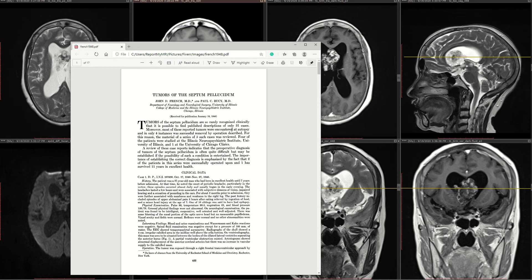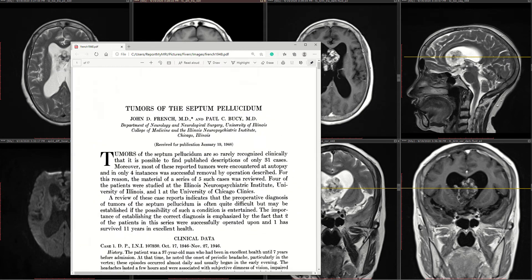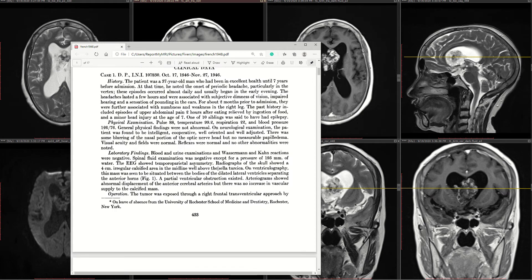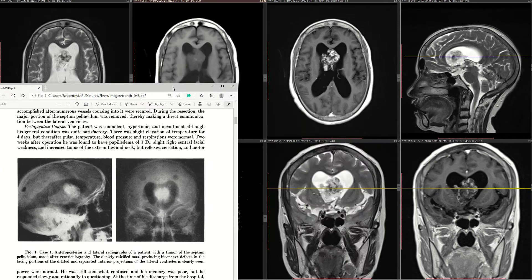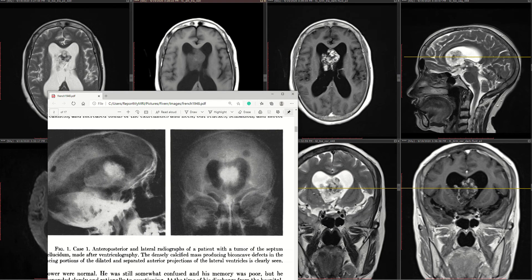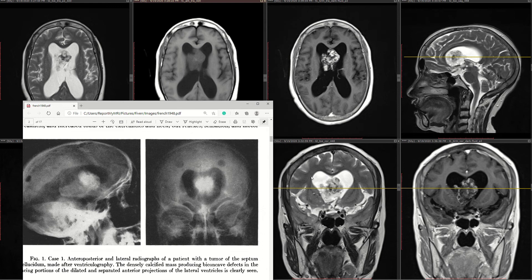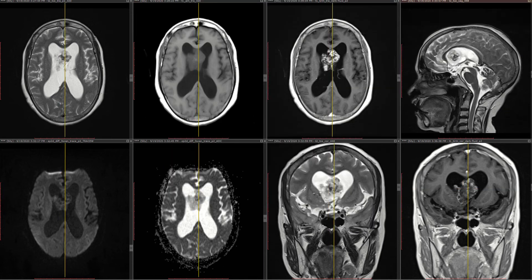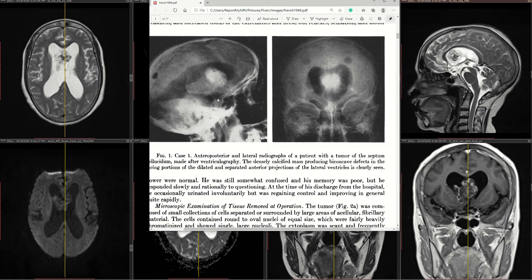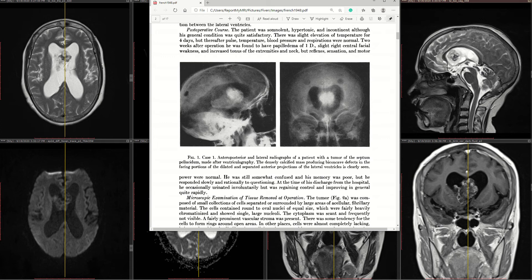I came across a paper written in 1948 by French and Bussi, where they performed ventriculography — air injected into the ventricles. Look at how close these two images are, almost more than 70 years apart. You can see a lesion involving the septum pellucidum with dilated lateral ventricles — remarkably similar, like a clone of the current case.